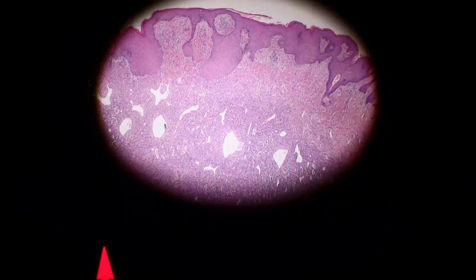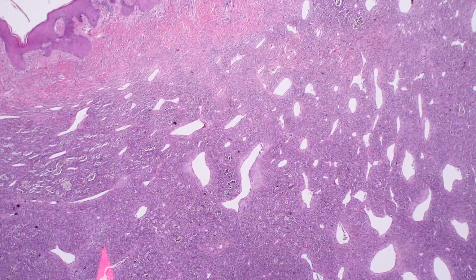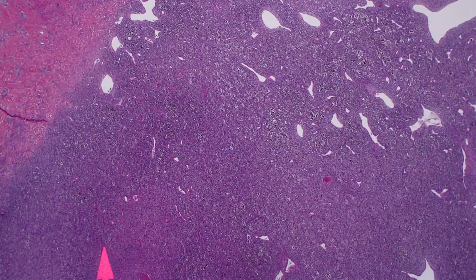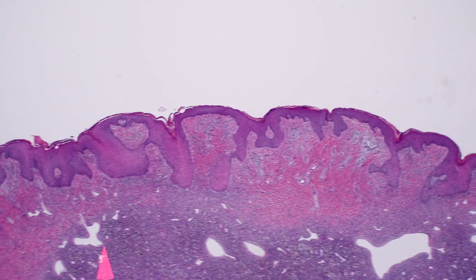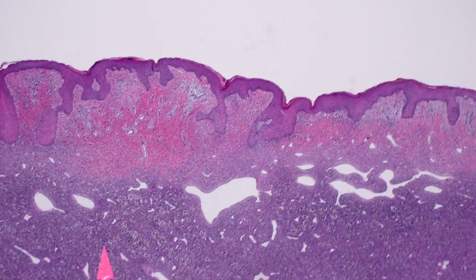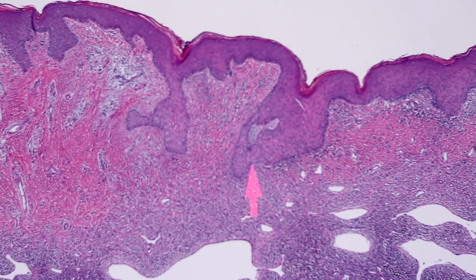So this is a good example of the aneurysmal form, a very large example of the aneurysmal form of dermatofibroma. Let me show you a couple other things from this case. Here's a different section, and you can again see beautiful epidermal hyperplasia, a little bit of that flat blunting of the rete ridges or tabling of the rete ridge here. You can see it comes down and then flattens out on the bottom.